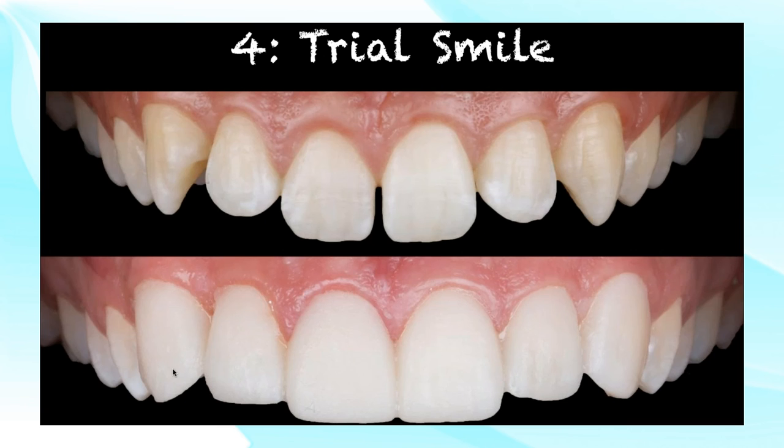But you don't only show this to the patient, you also take a photograph of it. Because if you take a photograph of it, you're going to show the patient, you know what? This is what we have right now, and this is what we need to do to accomplish this smile. So with high quality photographs, you're going to be able to communicate with the patient. With high quality photographs, you're going to be able to communicate with the lab.